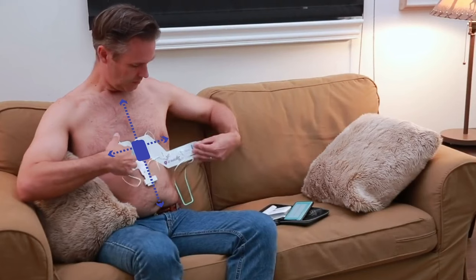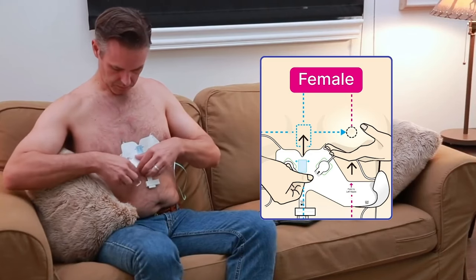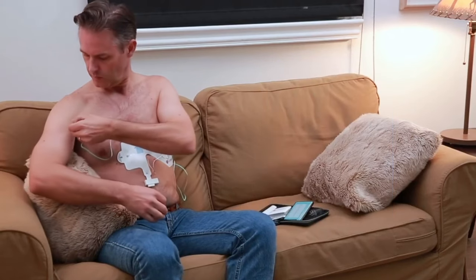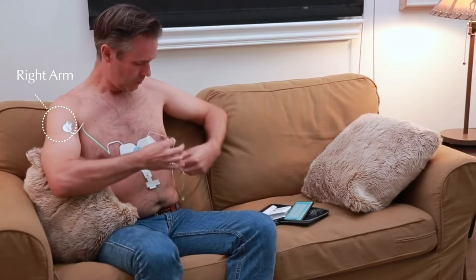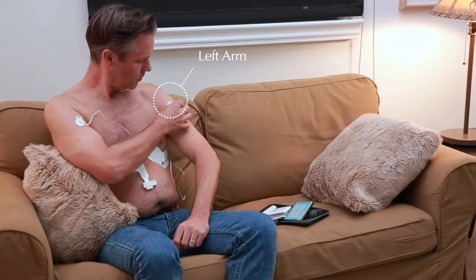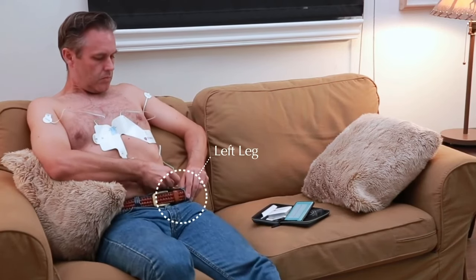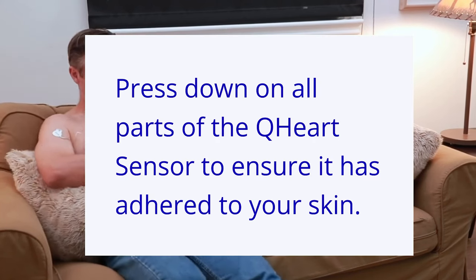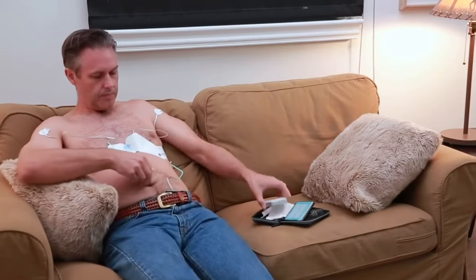Then wrap the sensor around the left side of the chest. For women, the sensor should wrap around the underside of the left breast. Pull the lead marked Right Arm and stick it to the right arm, the lead marked Left Arm to the left arm, and the lead marked Left Leg to the lower left abdomen or upper thigh. Press down on all parts of the Q-Heart sensor to ensure it has adhered to your skin.